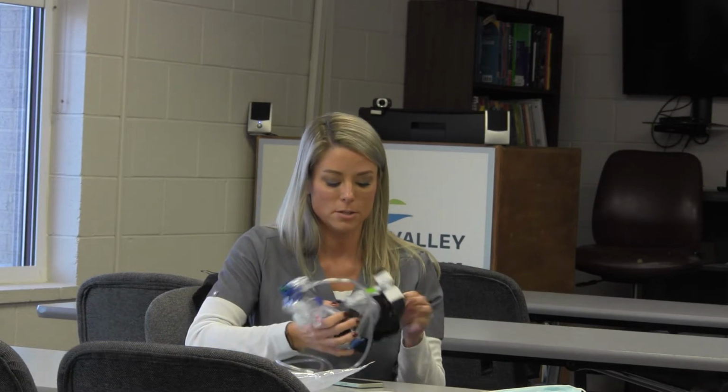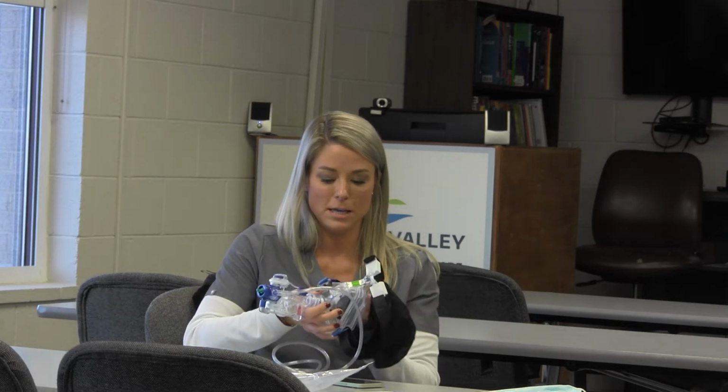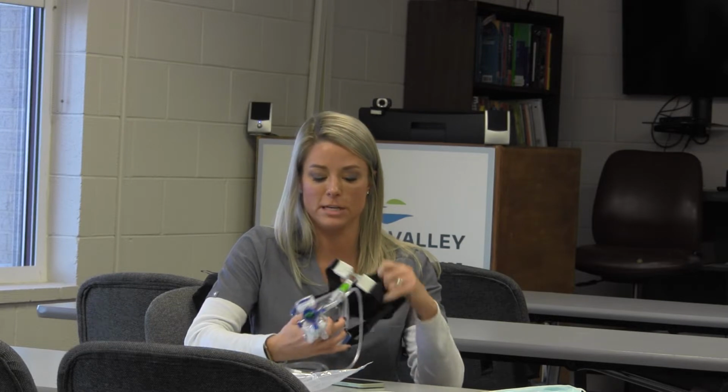But to give a neb treatment, it's always going to have to be in CPAP mode. So I would just always start out in that. It's a good rule of thumb. And again, the patient's not in distress, so you do have time to talk them through. Hey, this is going to help you do the work, and it's going to help your oxygenation go up.